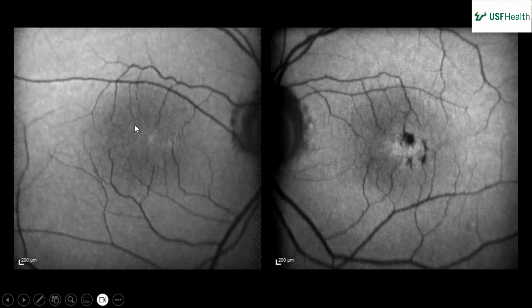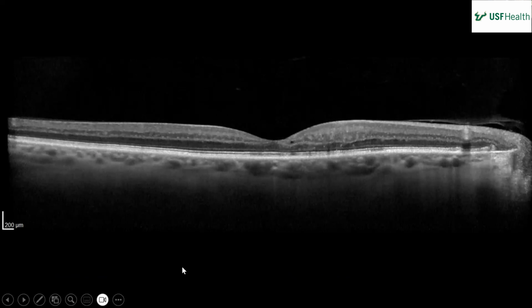And then the other thing on this one is if you have in your head somewhere normal autofluorescence, this is totally missing the dark spot. You should have a dark spot in the middle. This is missing it, and this one actually looks almost opposite because the retina started being damaged. But it's actually a bullseye. Yeah, but the dark spot's totally missing, which is a MacTel thing. Even if they didn't have crystals, that would be a MacTel thing because they don't accumulate macular pigment for some reason.